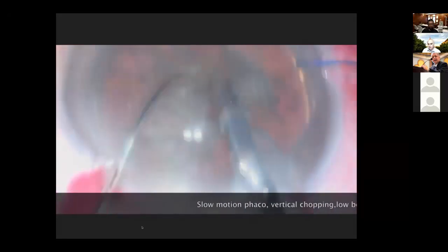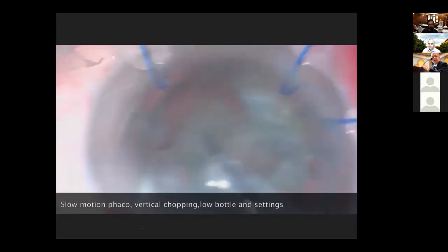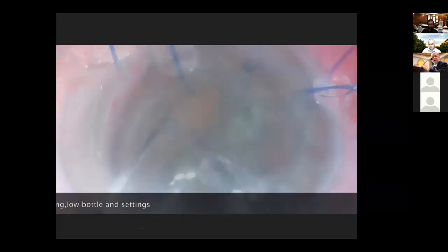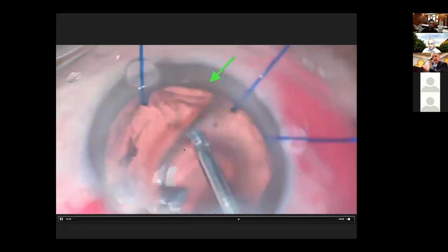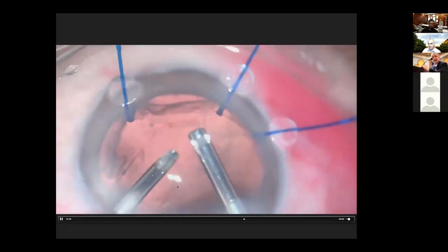Now I'm doing my regular phaco chop. And now you can see why the iris hooks are not the best, because they are a little bit sharp and short. You can actually tear the capsule, so you have to be extremely careful. And this is what happened. You can see here a tear in the capsule, and there is vitreous coming from the zonular area.